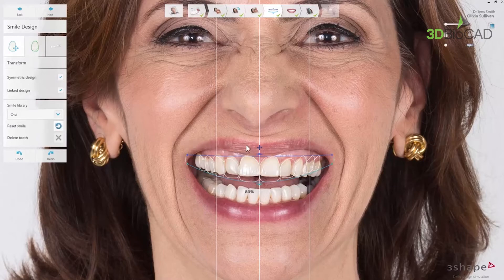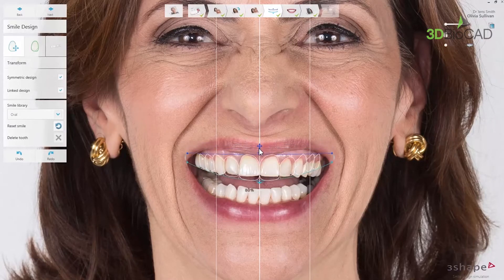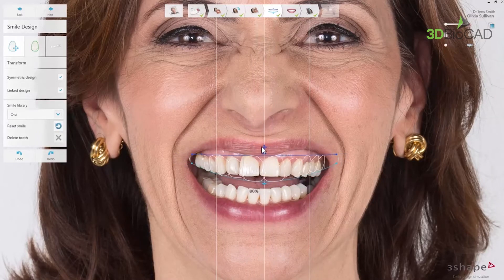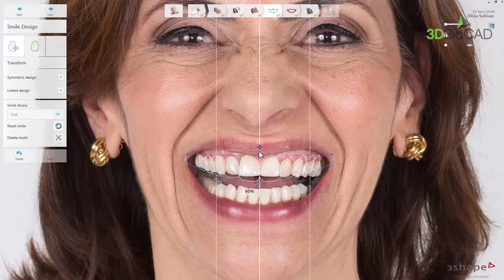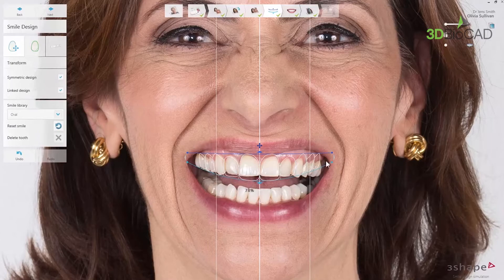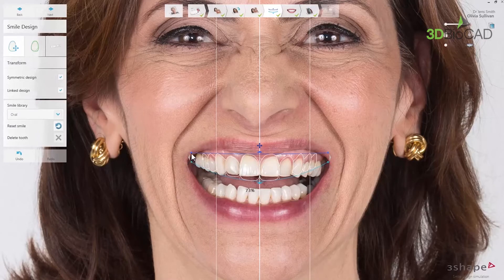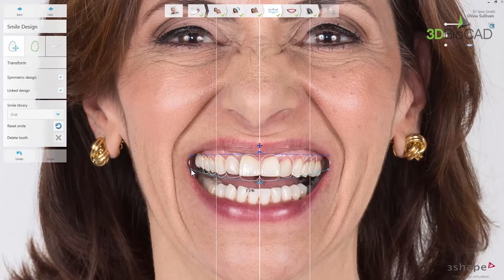The placement of teeth outlines can be adjusted easily using the control points. Hover over the smile frame to see the control points. Use them to move the smile frame up and down and shift it to the sides to align to the middle of the face. Scale it vertically using the upper and lower arrows, or scale the width using the lateral arrows. You can see the change in the percentage of the height to width ratio. You can also use the gingival and smile curves control points to adjust it in relation to the commissures and change the perspective of the teeth outlines.